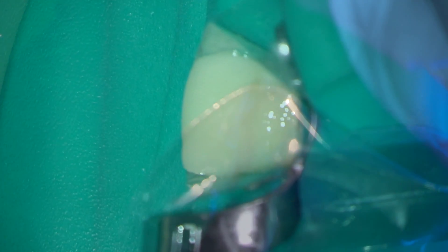The incisal tip was then rebuilt using a clear cellulose strip and light-cured composite.